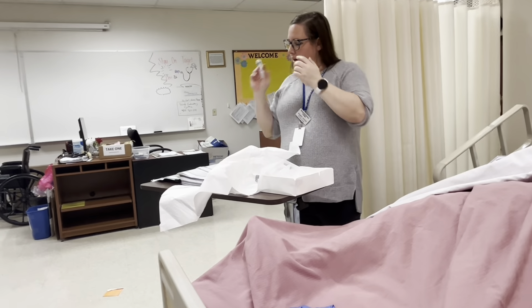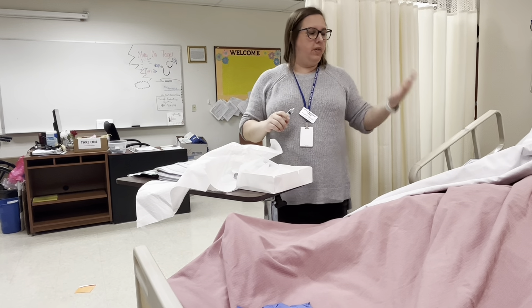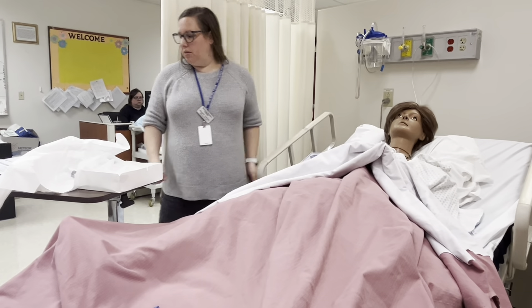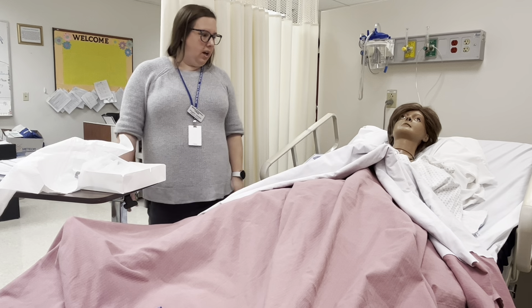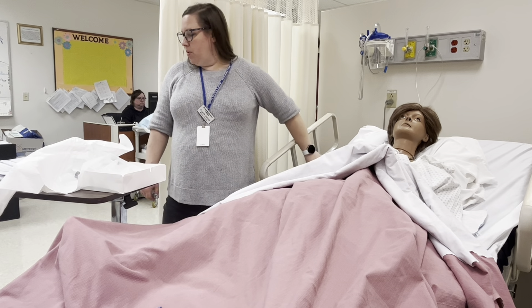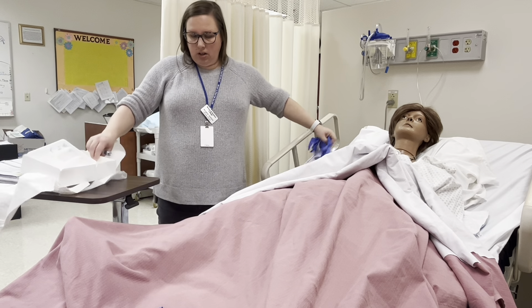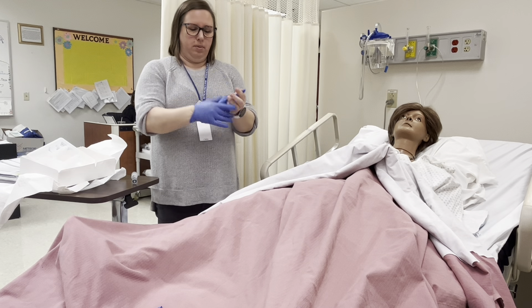To remove the catheter, I'm going to come in, knock again, introduce myself, and ask for two patient identifiers — Judy Smith, 10-2-1963. Judy, do you have any allergies? Penicillin, strawberries. Today I'm going to be taking out your Foley catheter. I am going to perform hand hygiene and put on my gloves. I just want to take a look at your perineal area before we start in case we need to do any cleaning up.